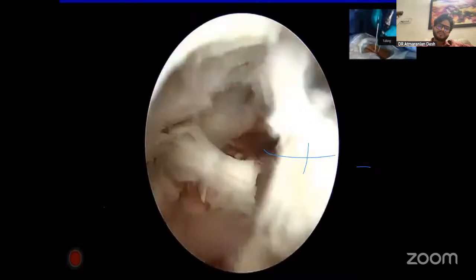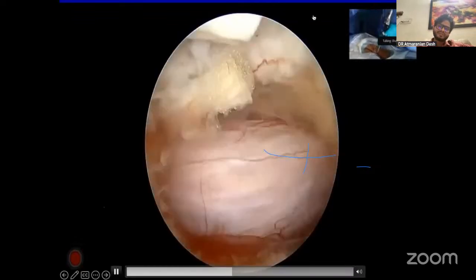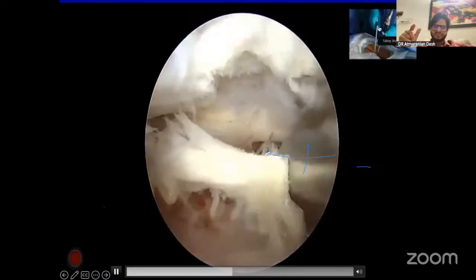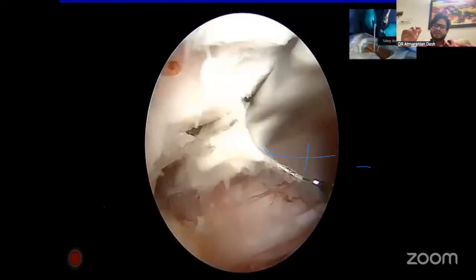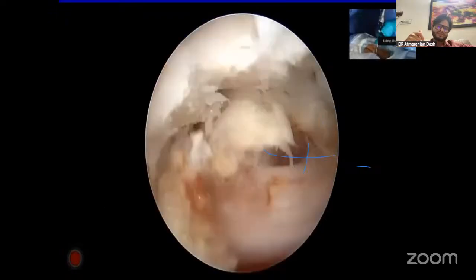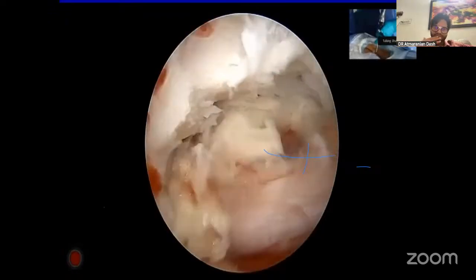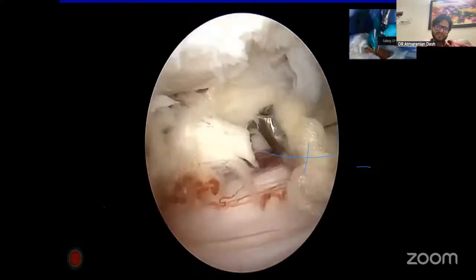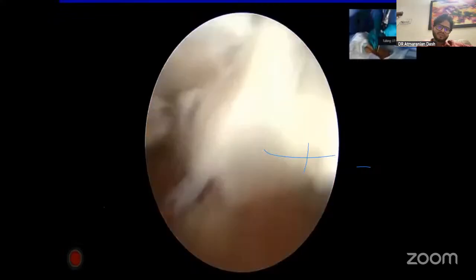Some of the people find difficulty in putting the instrument, because that is the key where you cut the fascia in a cruciate manner, which helps us to have a very fast movement inside the canal. So you see the ipsilateral flavum is completely removed. Now we are removing the contralateral flavum.